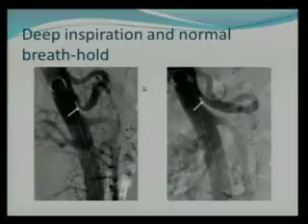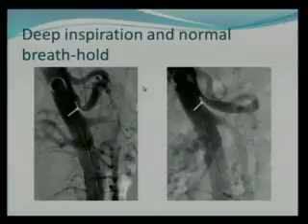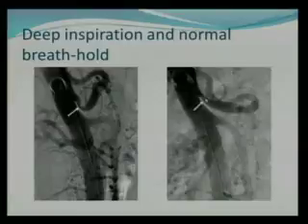It's worse with expiration? No. It's worse with inspiration. Because the diaphragm contracts, the median arcuate ligament contracts, it causes more impression. This is the deep inspiration and this is the expiration. This is a breath hold.